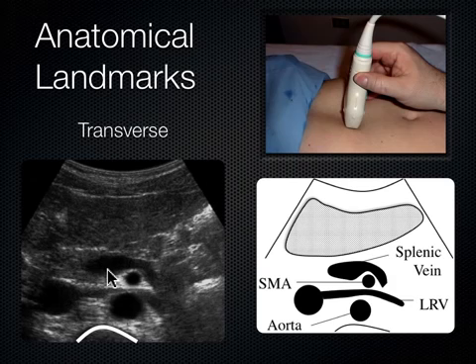So that's where that splenic vein is going to become the portal vein eventually, when it meets up with the superior mesenteric vein. Again, I realize you haven't had that anatomy yet, but you're going to start to see all these things on ultrasound really soon, so I think I should point them out. Outside that splenic vein, that's the pancreas over here, and then above here, this is all the liver. So I'll trace the margin of the liver as it comes around here, and then boom, there's the pancreas there.